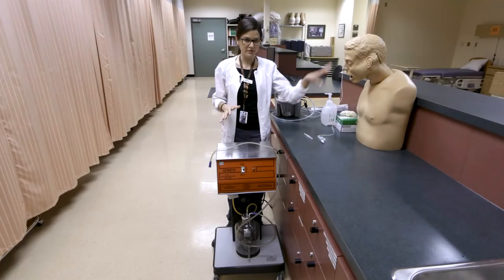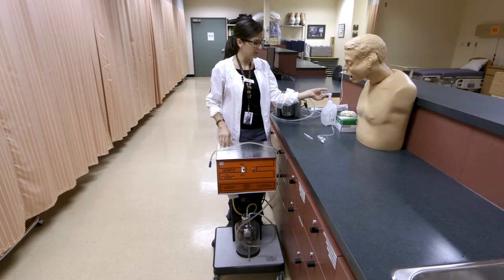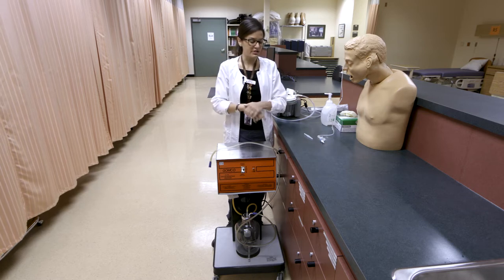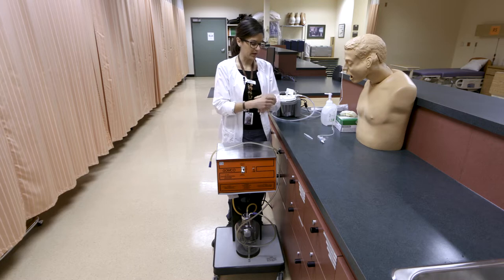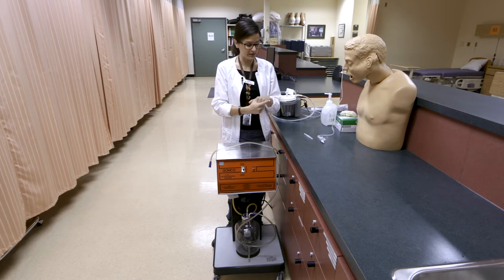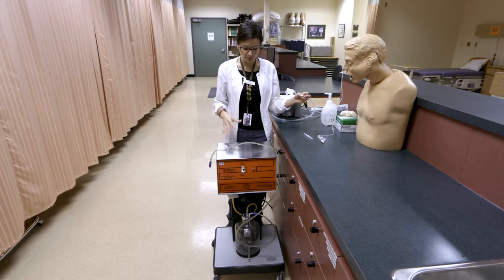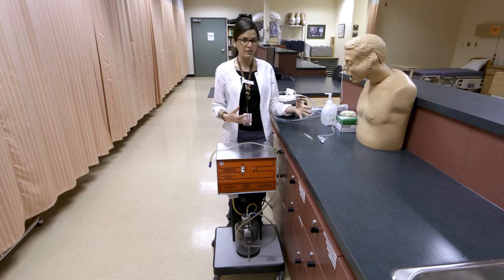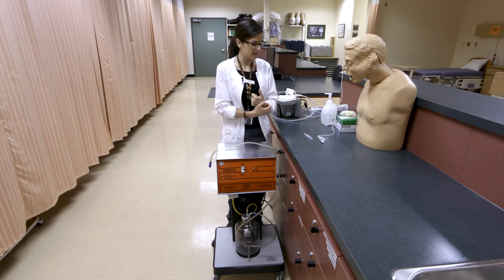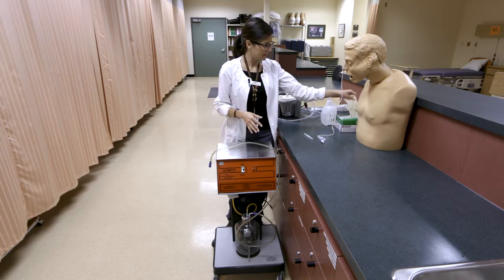I'm going to review setting up gastric suctioning to the NG tube. We had inserted this large-bore NG tube for gastric decompression. There are several different indications that your patient may need decompression, so you'd want to know that it's appropriate for your patient, understand why they're getting it, and then explain it to them. We have our supplies ready here.